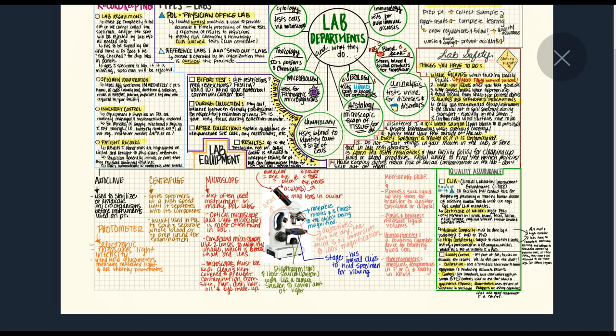And so a lot of students love to use the butterflies because you see the flash automatically, so you know if you hit the vein or not. And with the Vacutainer needles, you don't know if you hit the vein until you put the tube on. And so when I teach phlebotomy, I teach with Vacutainer needles first and then butterfly needles last for this reason alone, so that students don't become dependent on the flash with the butterfly. And the reason for that is because butterfly needles are so expensive.